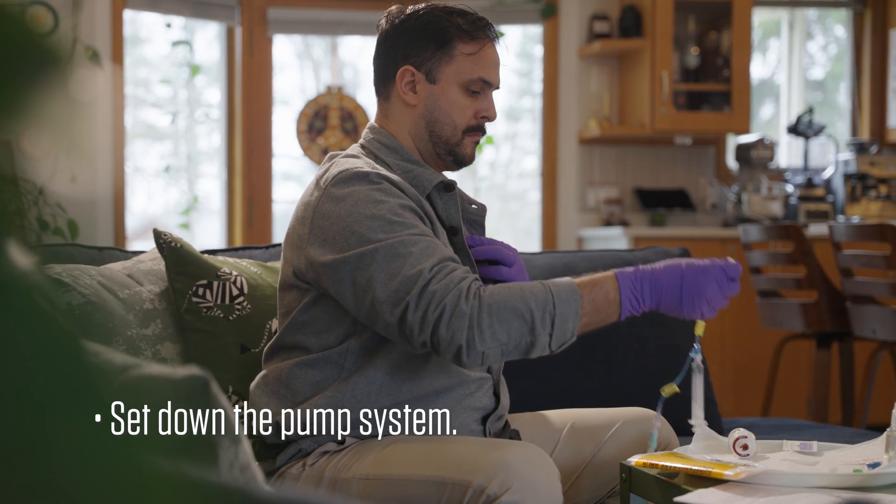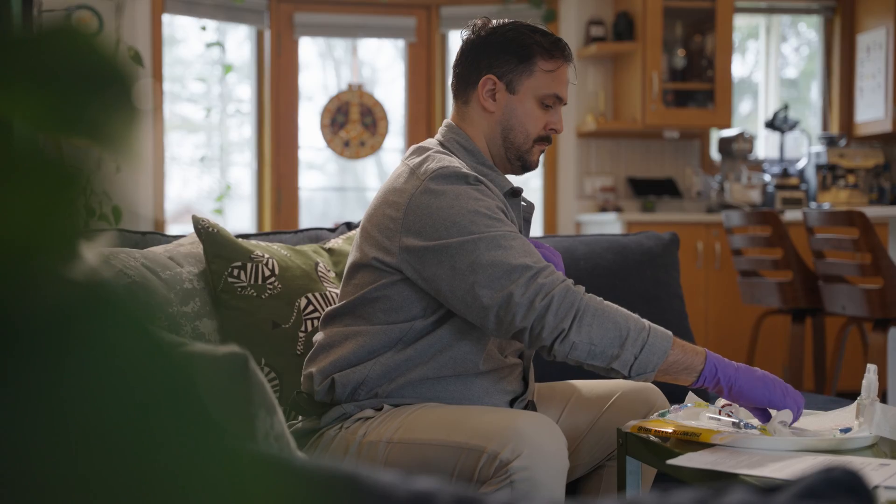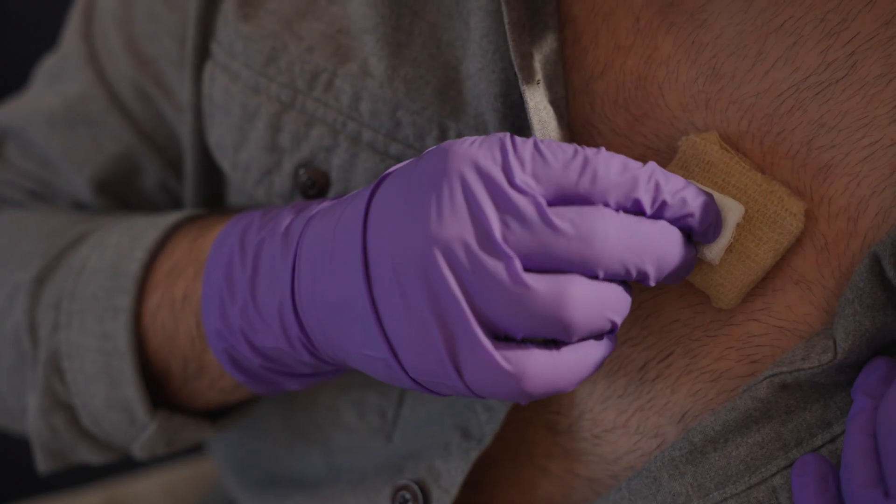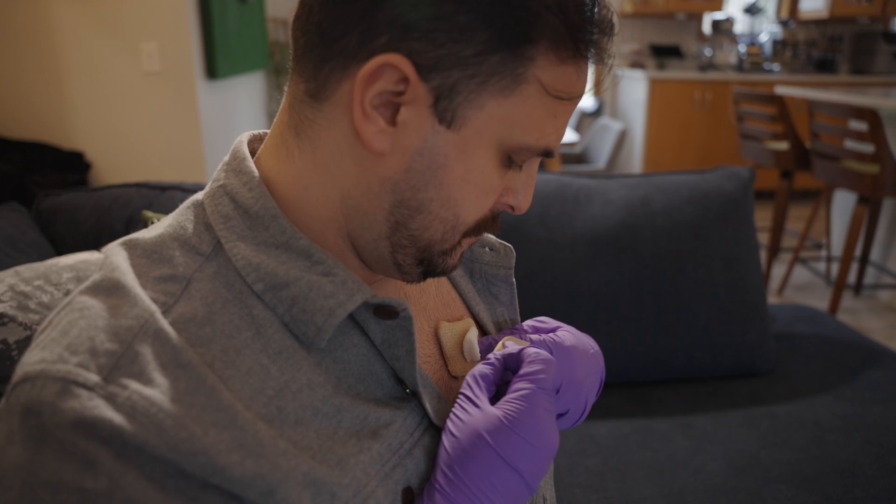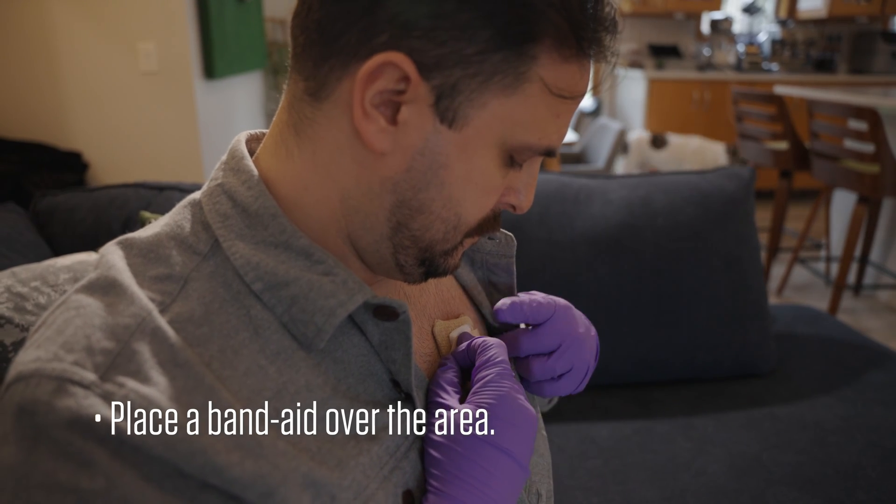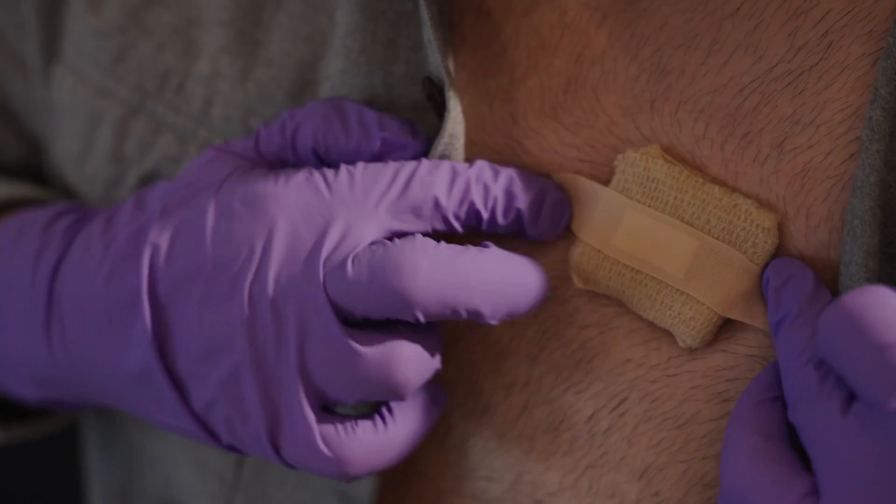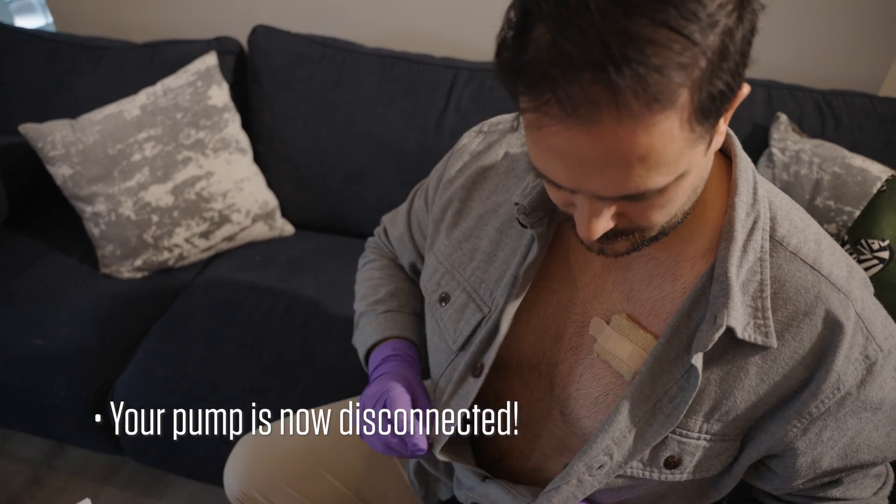Set down the pump system. Press the gauze pad against the needle site. Apply gentle pressure for 3 minutes. Place a band-aid over the area. Your pump is now disconnected.